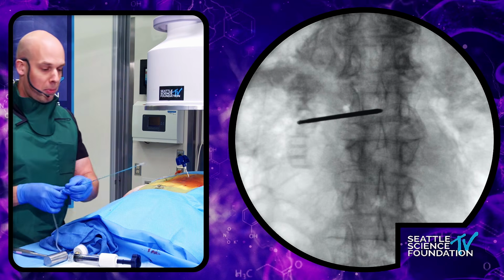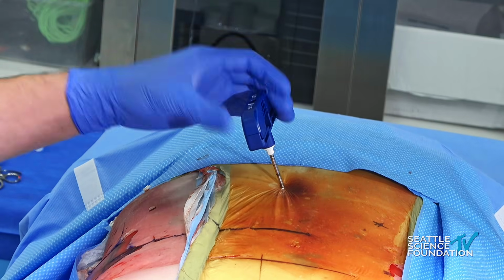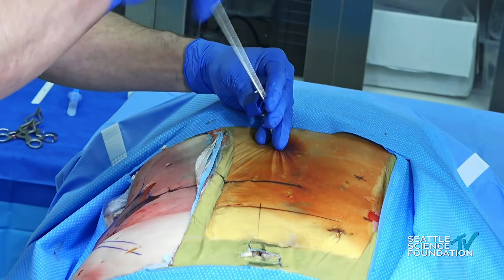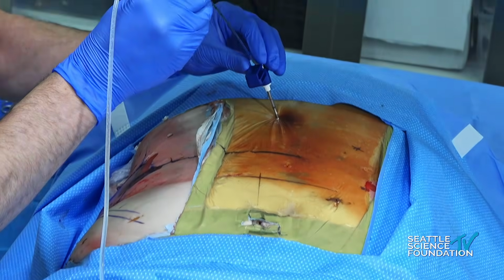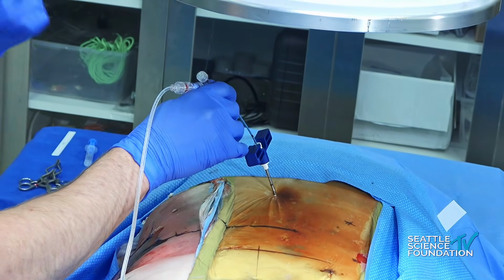So this is a low compliance balloon from IZI, which is nice because we can reuse it as needed. And then position, and then we'll go lateral here.